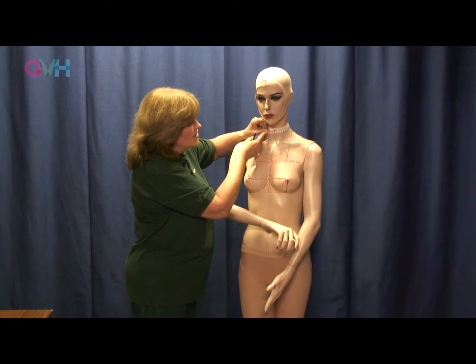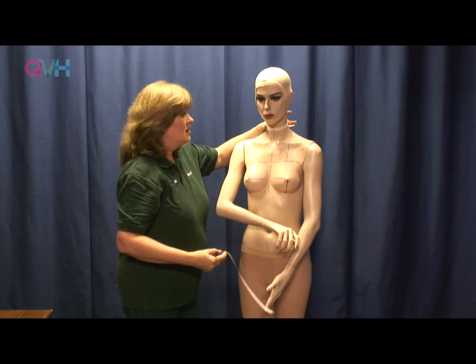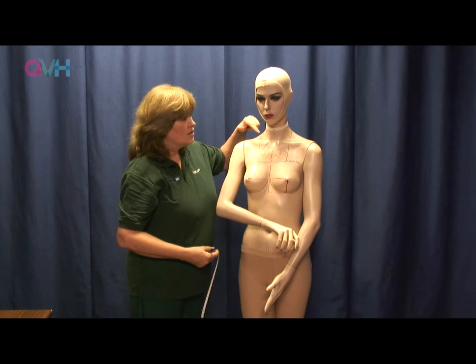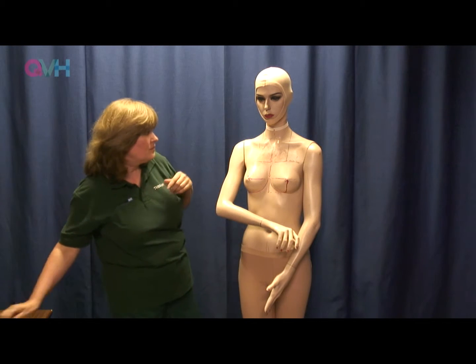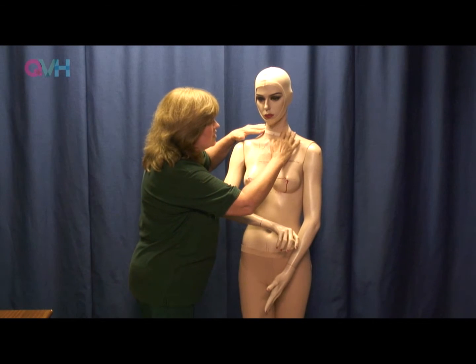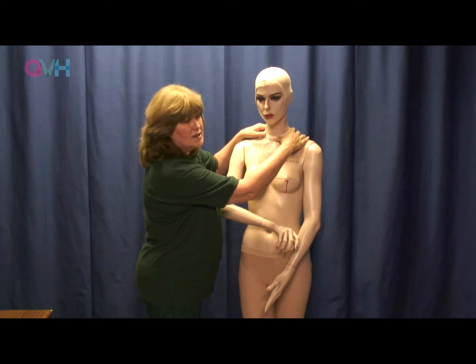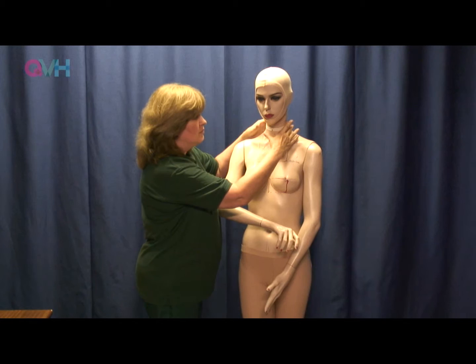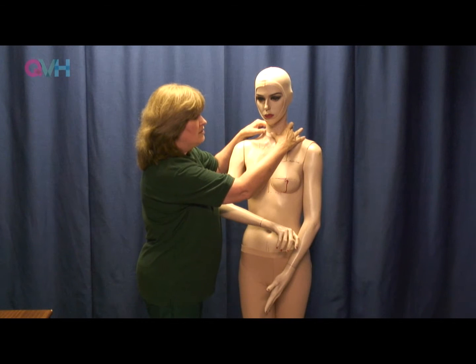In this instance, you'll notice I'm measuring the neck at what is probably a higher point than you would expect. You might think I would be measuring it on the collarbone because that is where the vest is actually going to sit, but this is why I'm showing you that measuring it on the neck, and then the garment being under tension, it actually pulls down into the right position because the garment is elasticated. What we want to know is the minimum that neck could be, and we don't make any reduction in the calculations for the pattern, and therefore it's pulled down.